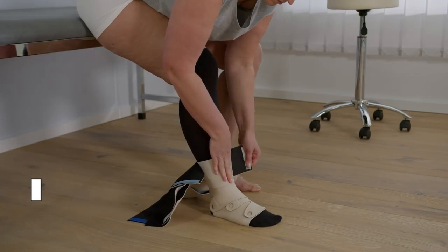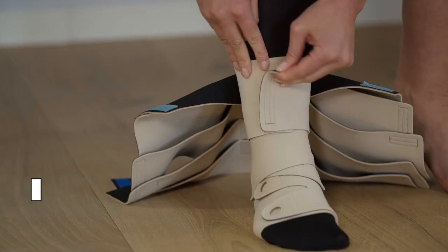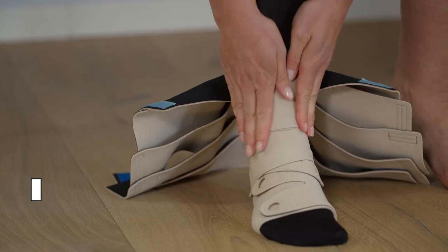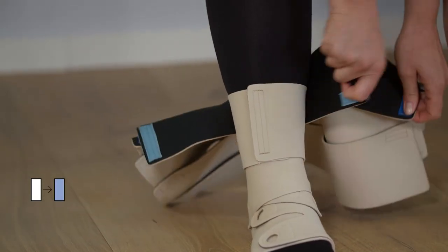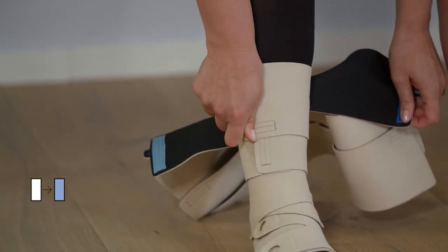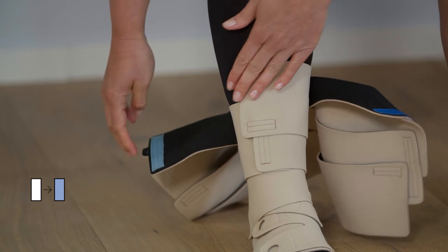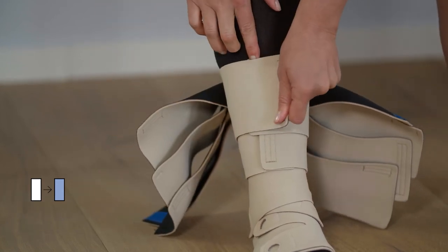ReadyWrap Calf: Place the strap without the fastener over the shin bone and secure it with the opposing strap, fastening it at full stretch. Then, in the next row, first fasten the strap with the short horizontal fastener to the strap below, then secure the strap with the large vertical fastener.